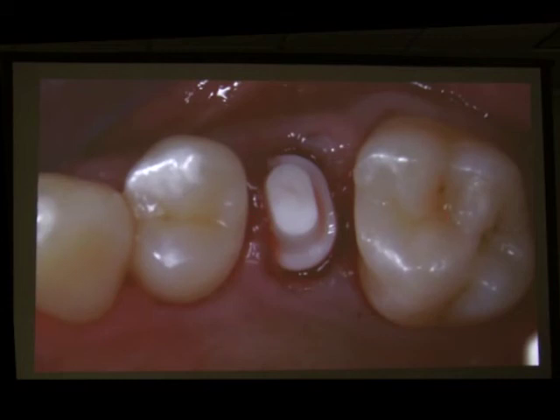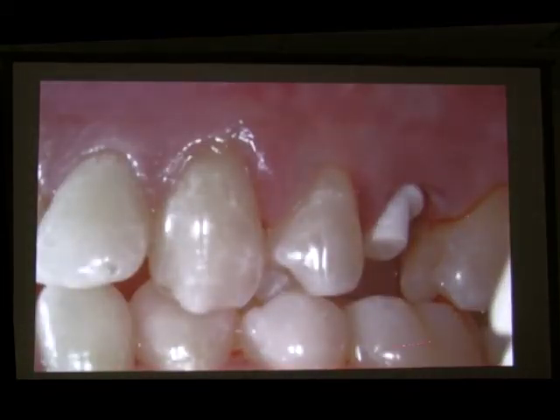It's a posterior side, so if the implant is exposed and the patient doesn't want zirconia showing, we prep. And this is day of surgery. On the mesial, it's more deep, and on the distal, we can see completely the margin. Look at the distance available in normal dentition. This is normal dentition. There is no recession, so most of the times, if you put the implant to gum level, you have this type of situation.